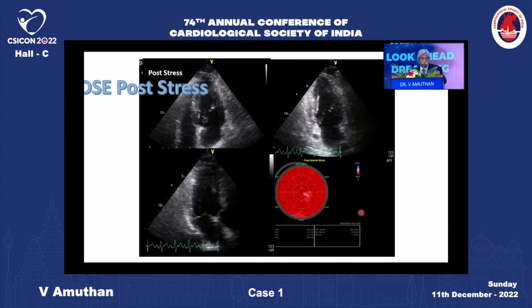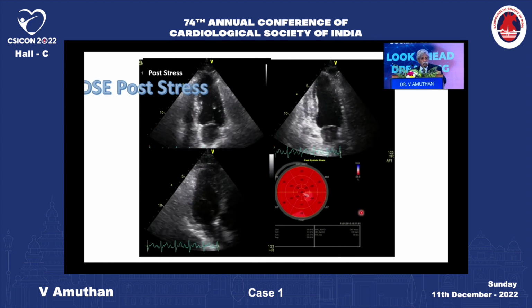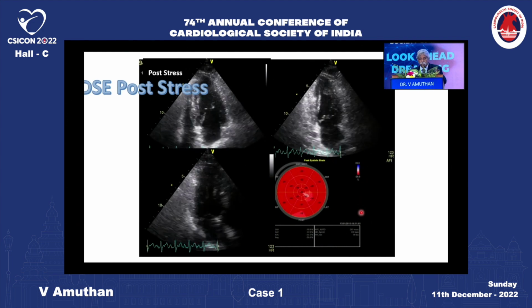So these two cases were interesting, and this is a new technology of using strain echocardiography for stress.